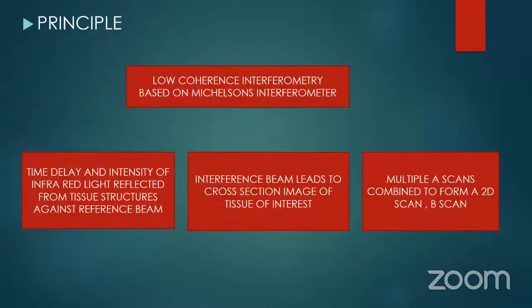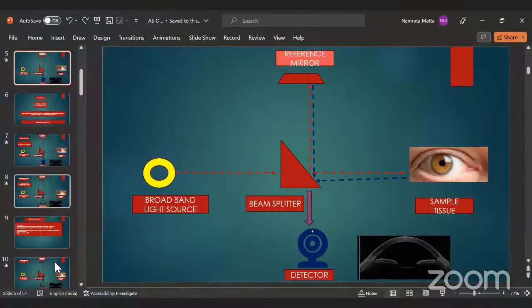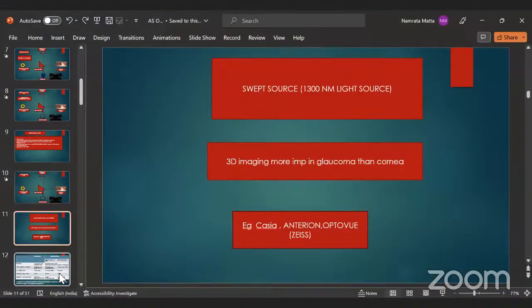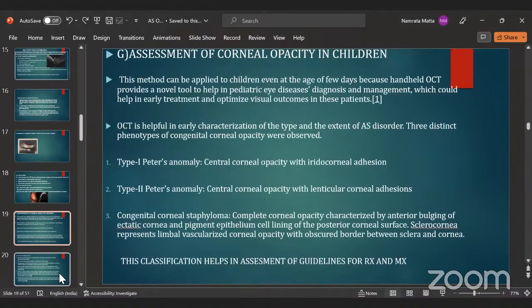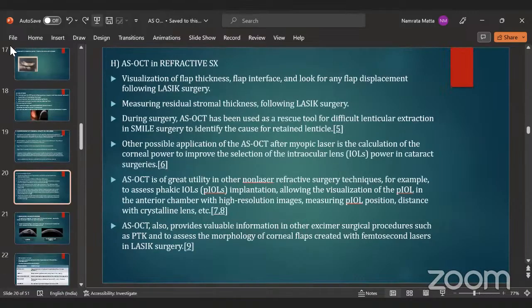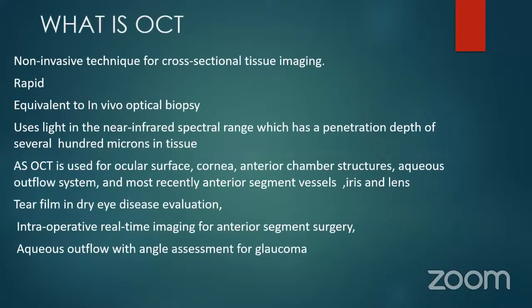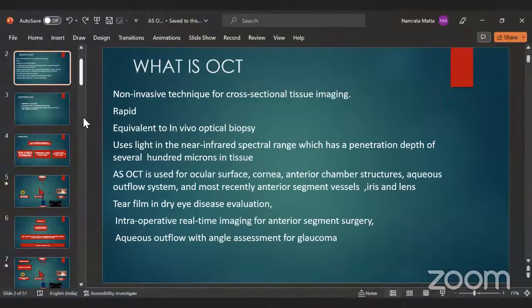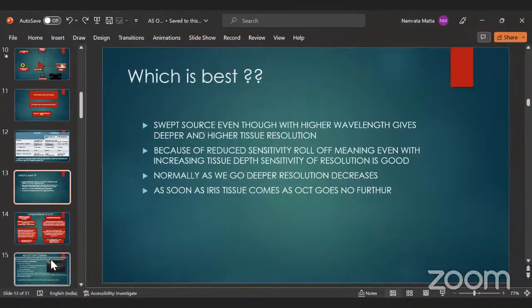In cases of refractive surgery management, it is of use as we can assess the flap thickness, flap depth.